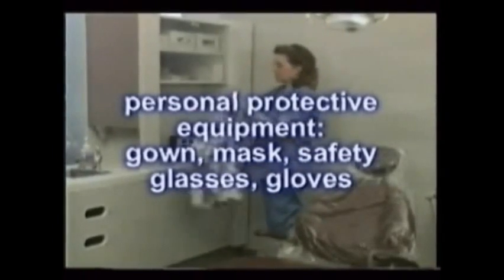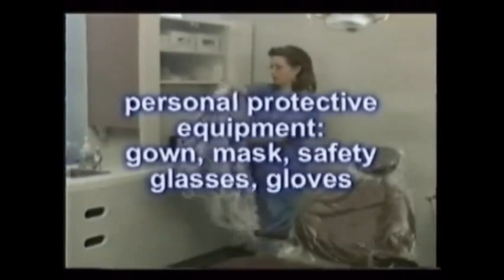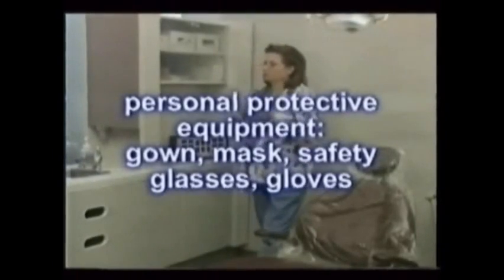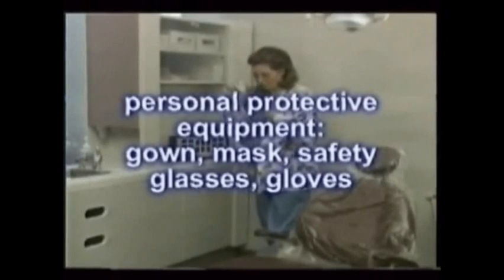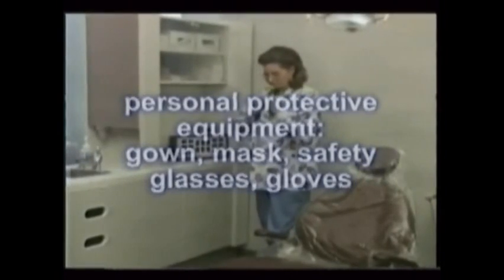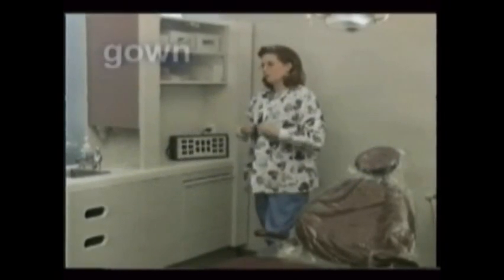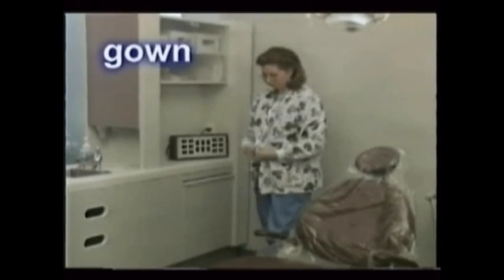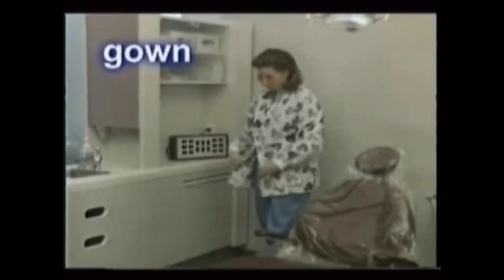Finally, you should put on the proper personal protective equipment according to the demands of the Universal Precautions Guidelines. Again, review the film on infection control if you have any doubts about the proper sequence. Watch as this assistant demonstrates placing the gown, mask, safety glasses, and gloves.